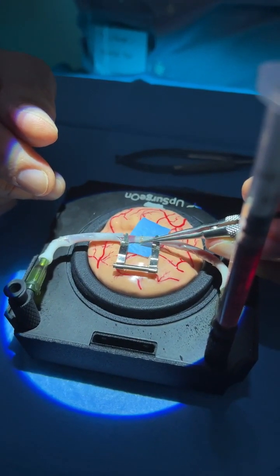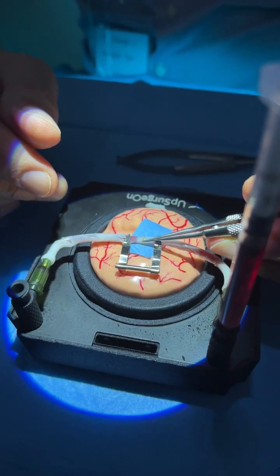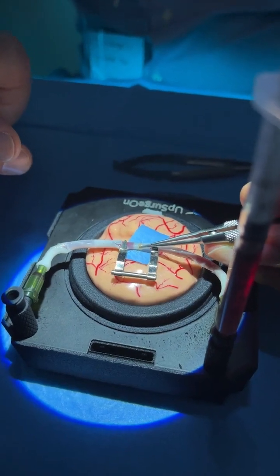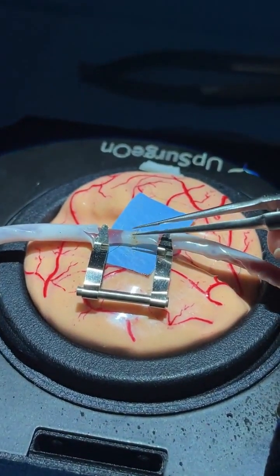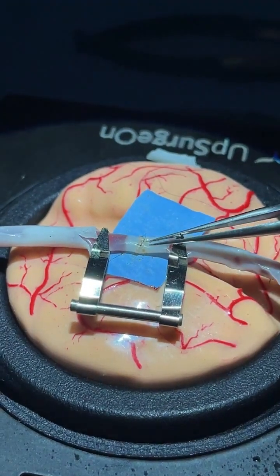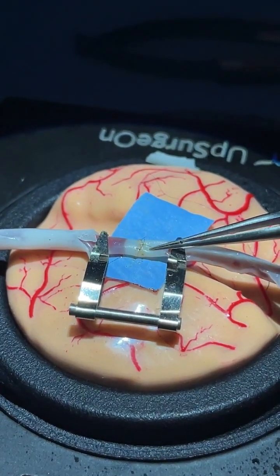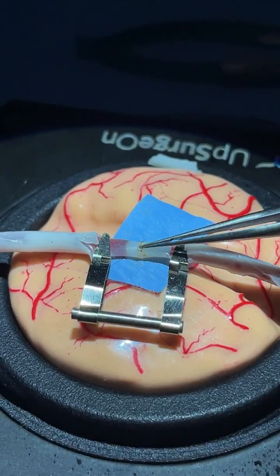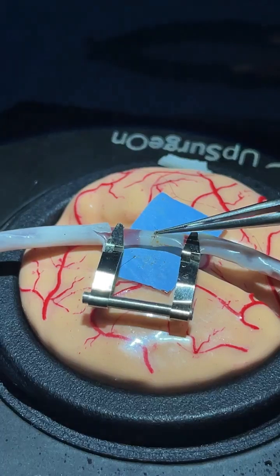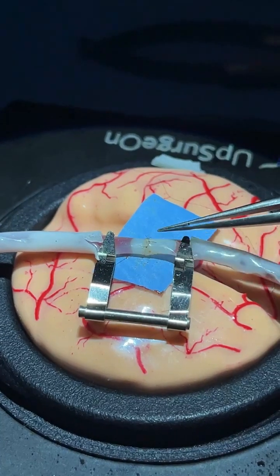When you remove the clamps and try the patency test, you may have a little bit of bleeding. You can manipulate the anastomosis — but do not take the vessels directly, as you could damage them. Instead, just take the suture and move the vessel using the suture, then place the last stitches that you need.